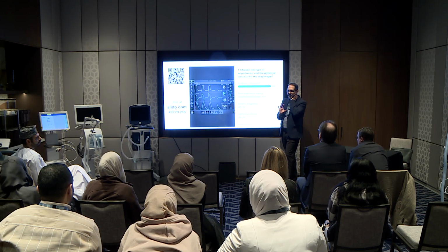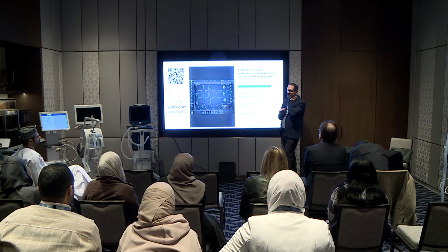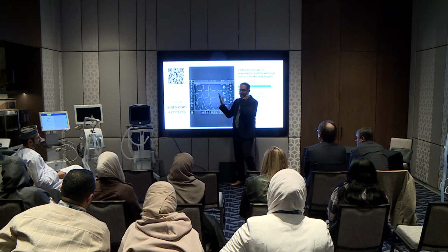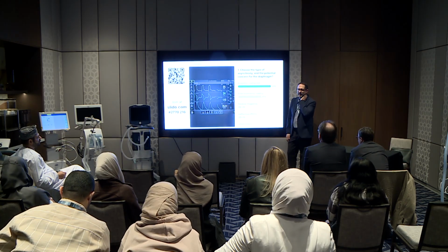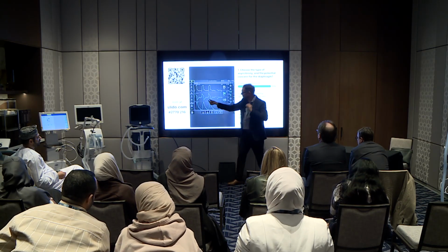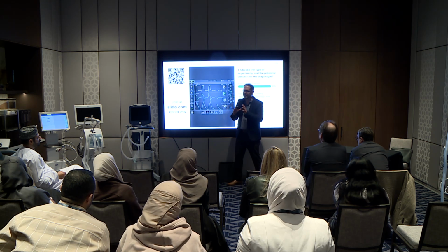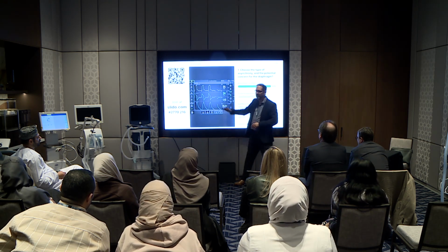We already had this picture. Is it reverse triggering? How do I tell? It's definitely not. There's a trigger on every breath, so forget that one. Ineffective efforts, yes. They're in between each breath, that's ineffective efforts. When it's really close to here, you have to consider whether it is ineffective or short cycling. And in this case, it's ineffective. It's very consistently in between each breath.